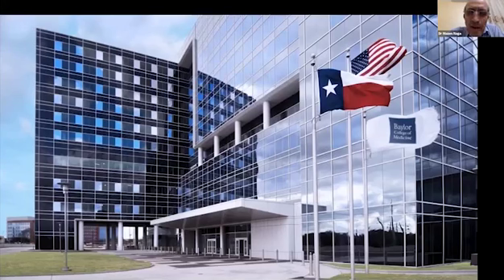The problem is that you put the patient on his face and raise the table so his head is up, so the blood will trickle away from the fundus and you can see the fundal varix very easily.